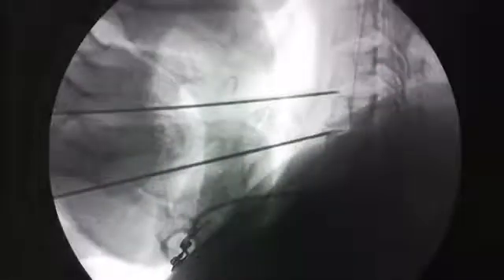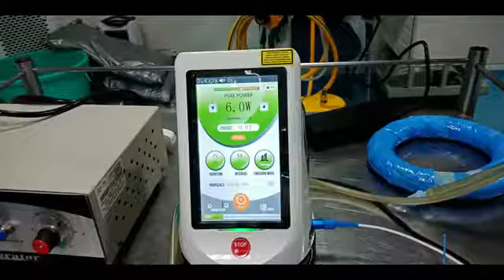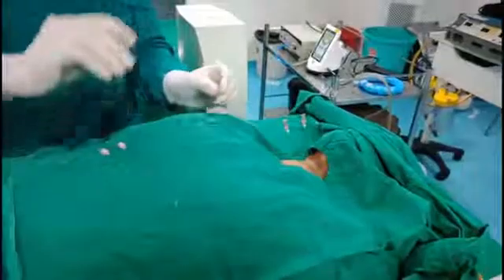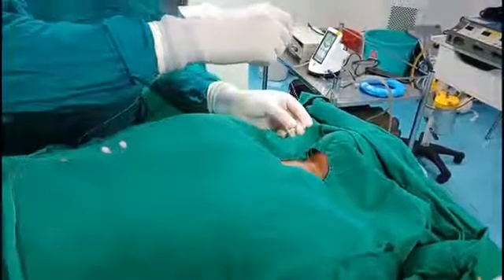Again, you see in the lateral view and see how the needle is slowly entering parallel to the end plates up to the middle of the disc. Now it's time for the laser therapy. We're putting the laser fibers, already predetermined, into the needle.